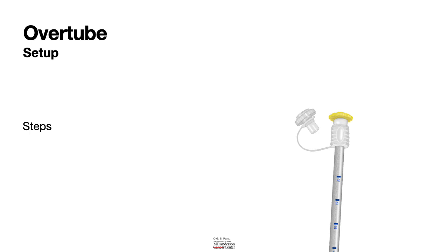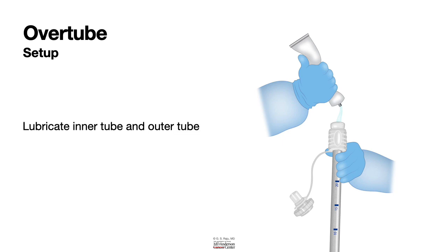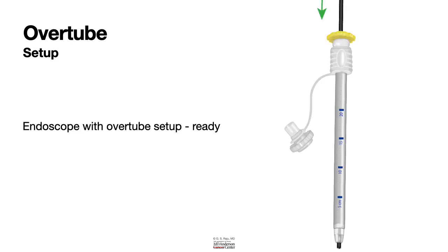First step is to remove the inner tube and then lubricate both the inner tube and the outer tube. Generous lubrication is very important. And following that lubrication, you insert the inner tube into the outer tube till it is almost snug, and then you insert the endoscope into the inner tube till the endoscope comes out through the other end. Now, with this setup, the endoscope with the overtube is ready for use.